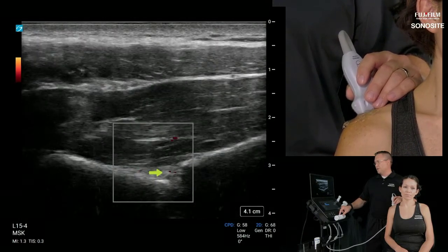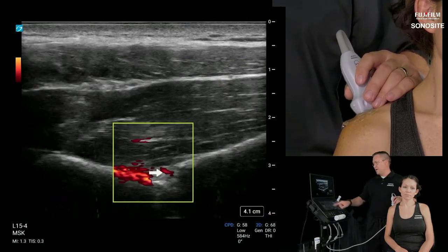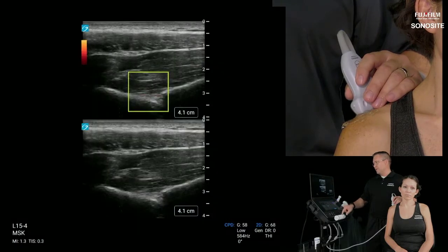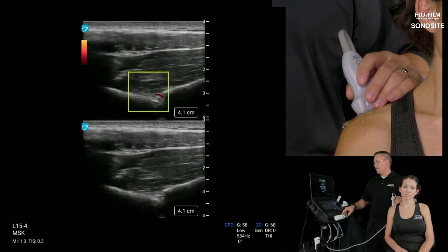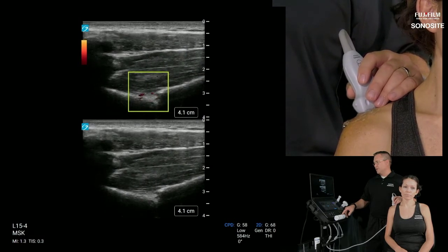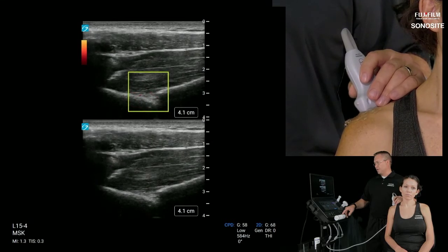what not to hit. If you're doing a deep procedure, this is also a good time to activate the color compare feature on the Sonosite PX. I'm going to select top bottom, so I activate the entire transducer, but here you could drive your needle in real time and see where the color was on the screen, indicating where the artery is versus where your needle might be in grayscale, so that that ROI box and any flash artifact that's showing up is not showing up in your image on the bottom.